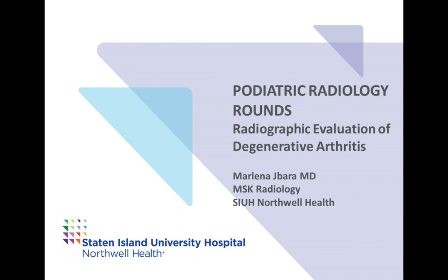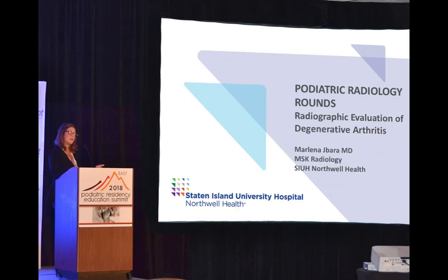In this lecture, we're going to evaluate radiographic evaluation of degenerative arthritis. My name is Marlena Jbara, and I am a bone and joint radiologist at Staten Island University Hospital at Northwell Health.